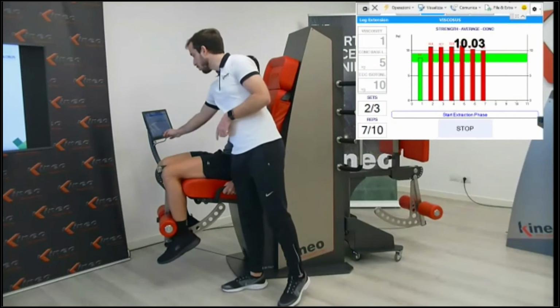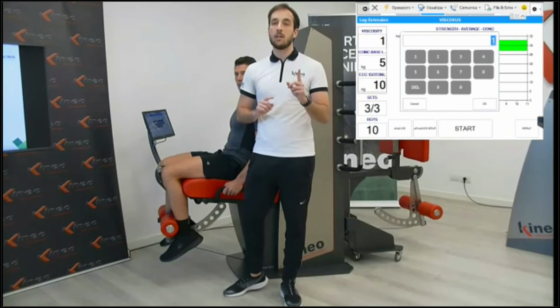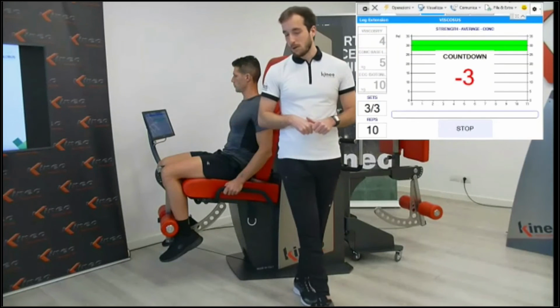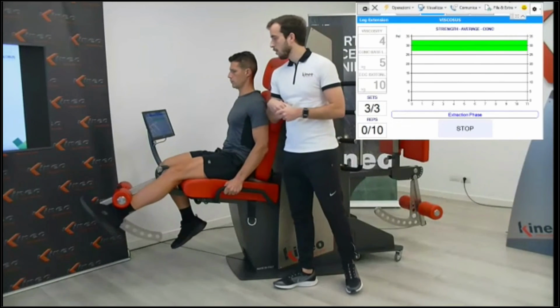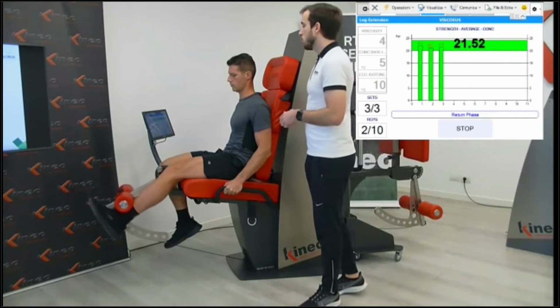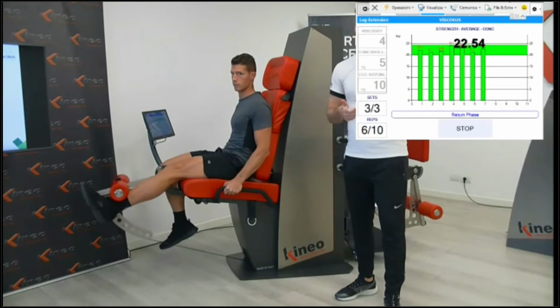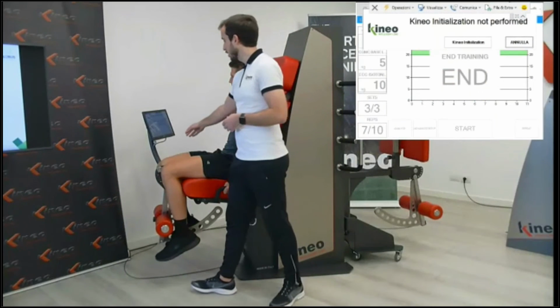Okay, stop. We do a quick change because now I'm not putting him in Visco 1, but I'm putting him in Visco 4. So remember the graph, the higher viscosity. Now try to keep a very fast pace. All right. Now he's producing 21, 22 kilograms. He's definitely making a different kind of fatigue, of effort during this exercise.